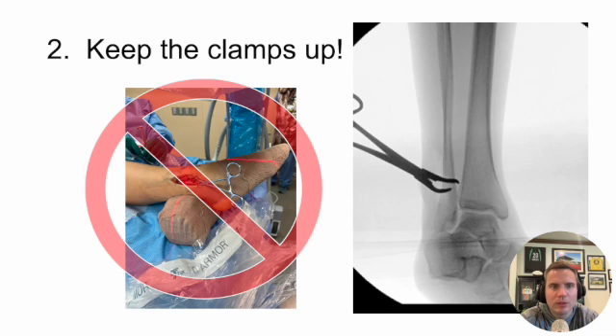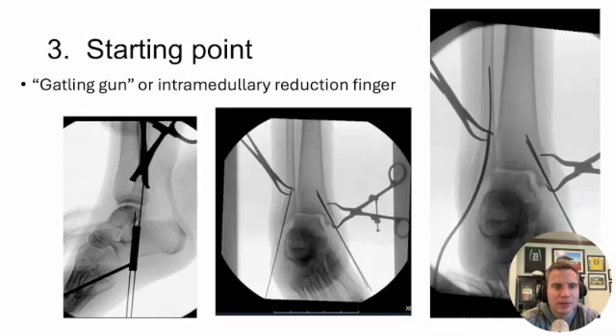Tip number two is keeping your clamps up. If you put the clamp down toward the foot — as I'm showing in the crossed-out section here — your outrigger on the fibular nail will hit the clamp and won't allow you to advance, or you'll displace your fracture. So put the clamp headed toward the head so it stays out of the way of the outrigger. Most reps you work with will call this out, but if it's your first time and you put the clamp on down, you're going to run into problems — easier to do it right the first time.